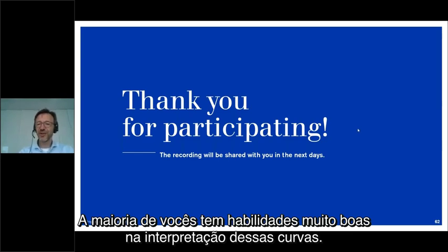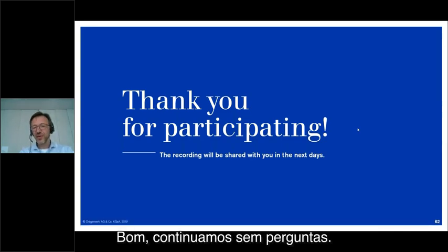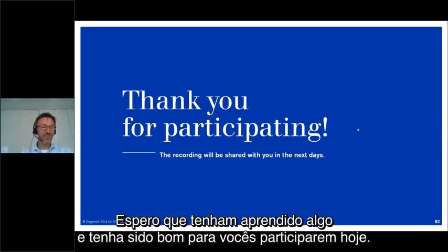Most of you have really very good skills in interpretation of these curves. We still have no questions, so it seems to be quite clear, which is very nice. I hope that nevertheless you have learned something and it was good for you to participate here today.